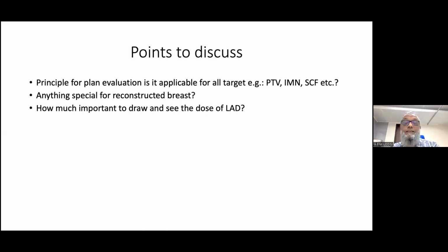Some of our colleagues are asking about D mean. You said 6 to 8 in some, without DIBH. In your center, what is the maximum heart dose you accept without DIBH? So in our institute, we have seen without DIBH, left-sided breast cancer, D mean goes around 8 or 9. It can also go to 10. So in such cases, are we not taking a big risk with 8, 10, because beyond 4, there is always a high risk? Yes, sir.